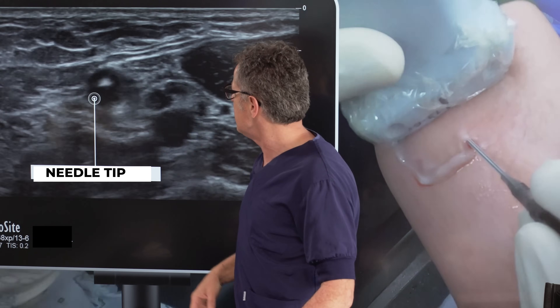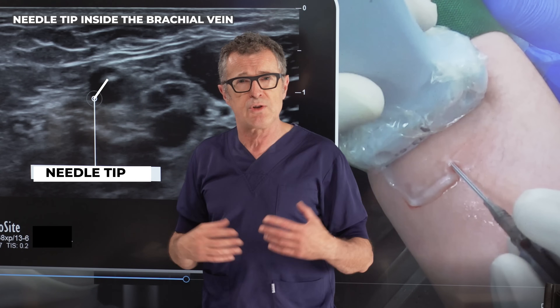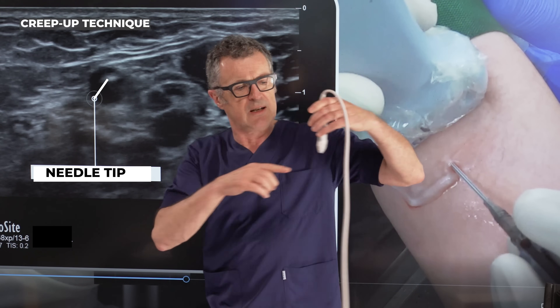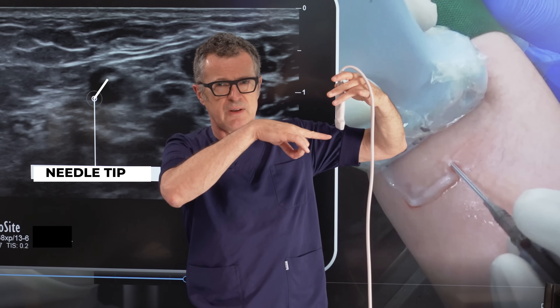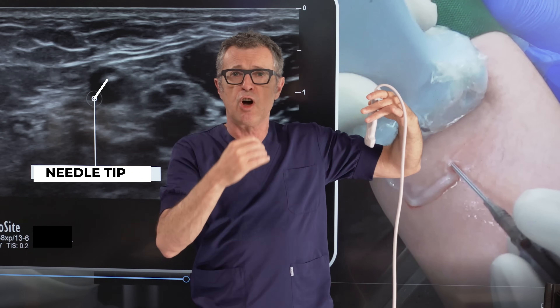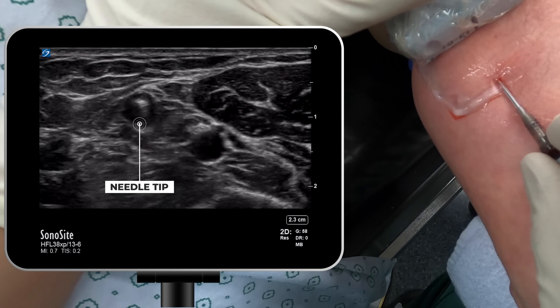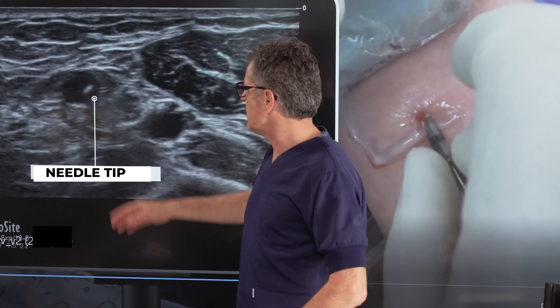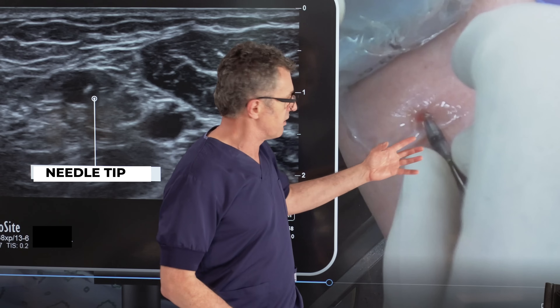As we continue advancing the needle, we can see the needle tip is now inside the brachial vein. At that point, we're going to use what's called the creep-up technique. As you advance the needle and follow its track with the ultrasound, you need to advance the needle and move the ultrasound probe further — advance, move, advance, move — so you can always see the tip of the needle on ultrasound. We continue moving the transducer more proximally as we advance the needle inside the vein.